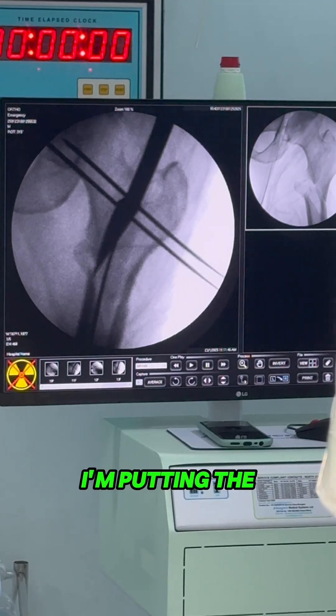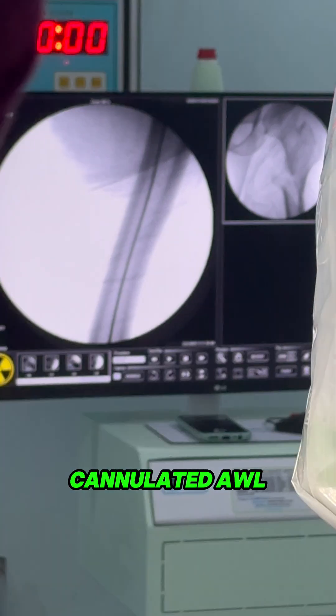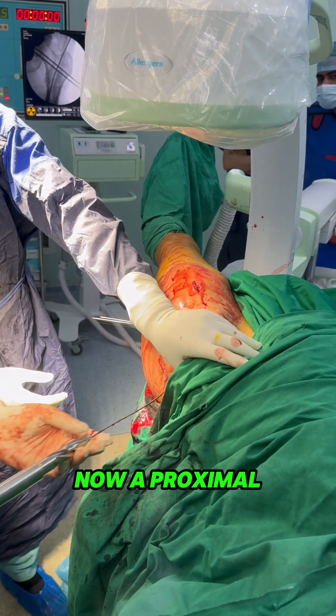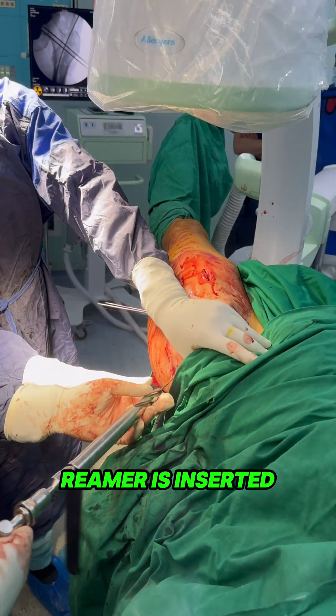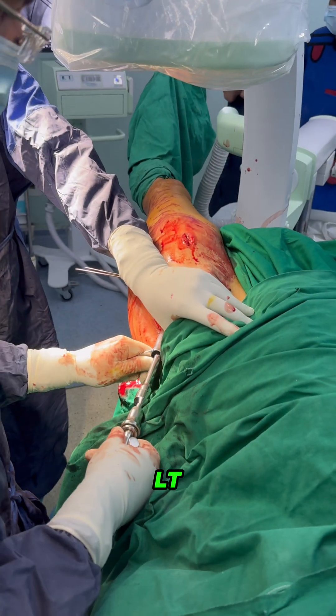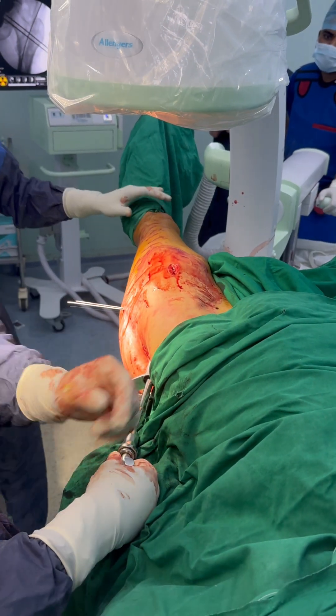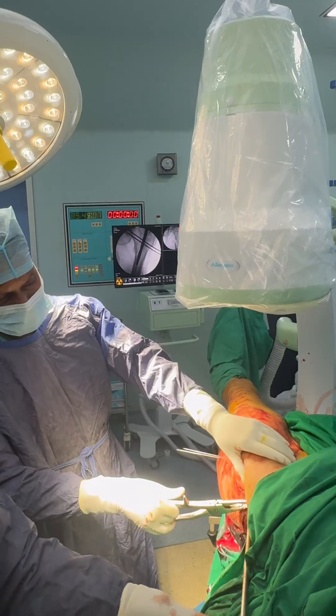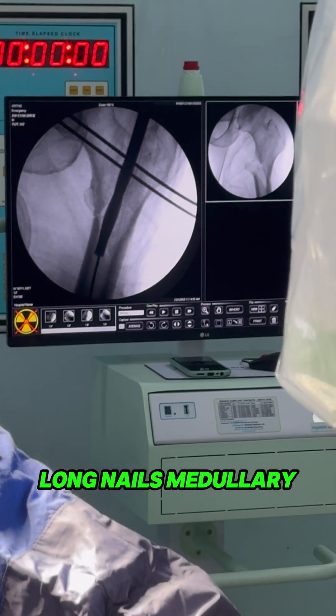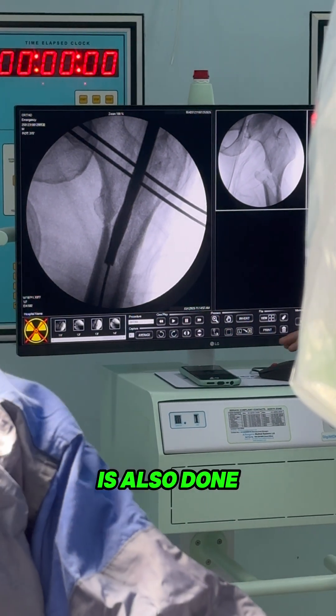Here I am putting the guide wire through the cannulated awl. Now proximal reamer is inserted and reamed up. In case of long nails, medullary reaming is also done.